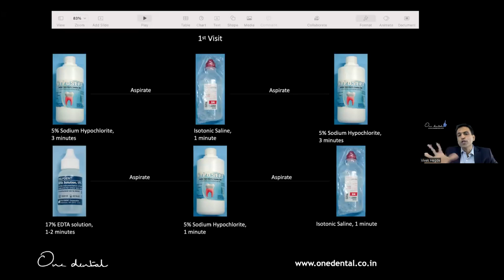Till then, you use what you want, doesn't matter. You use hypochlorite, you use normal saline, I'm okay because I don't count it as an irrigation at all. I use hypochlorite, of course. This is just a way to say. This is my first visit. Suppose a second or a third visit comes, use hypochlorite, wash off for a minute.